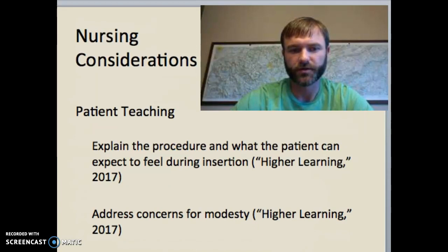Prior to inserting a Foley catheter, the nurse should take a moment to educate the patient about the procedure. The nurse should explain the procedure and what the patient can expect to feel during insertion. This includes pressure, some temporary discomfort if there is an enlarged prostate, and then relief as urine is released.